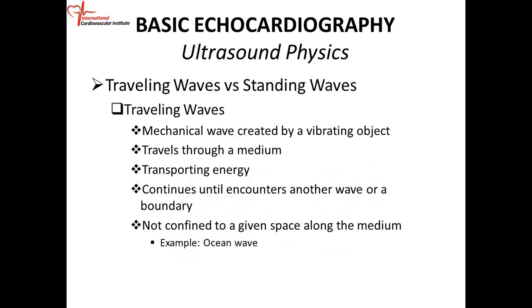The sound wave now travels from the transducer or the probe to the structure, and we call the wave that's traveling to the structure the incident wave. Some of that incident wave is going to be reflected backwards to the transducer. So the sound is going to travel backwards to the transducer, and that sound wave is now going to be converted to an electrical signal, and you see it in the image.